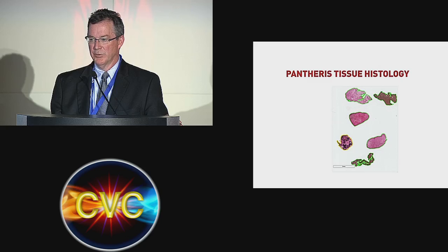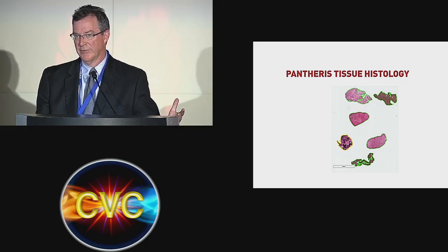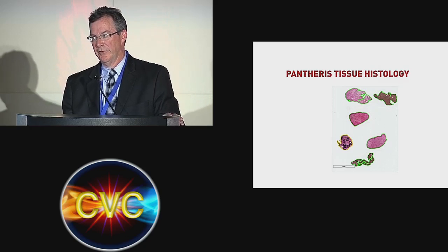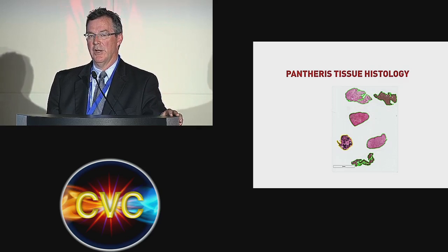But if you look at the actual tissue histology, there was about 3% media, and no external elastic lamina noted in there whatsoever. So this was really all plaque that was in that vessel. The vessel is more diffusely diseased as we look at it. So very, very successful in terms of actually cutting out true plaque rather than the media itself.